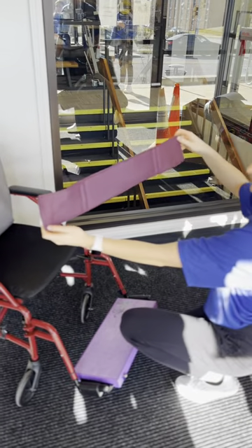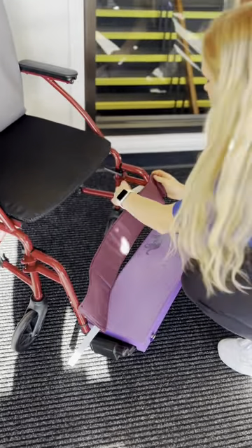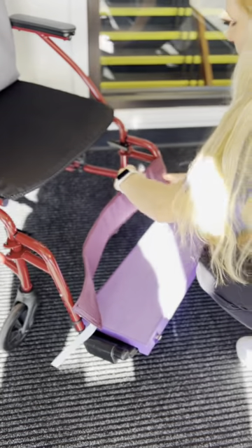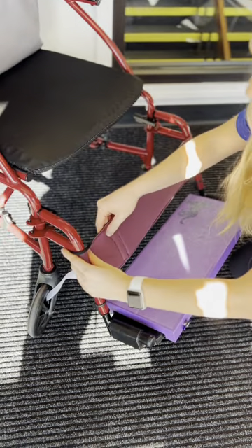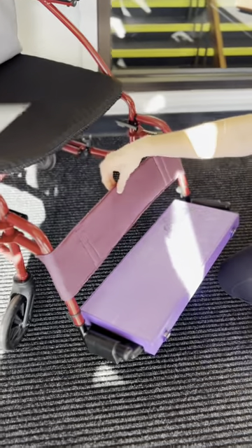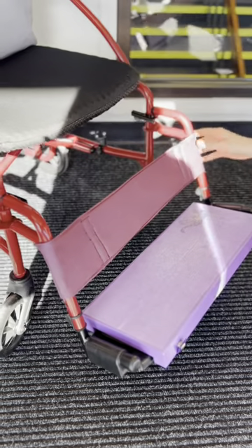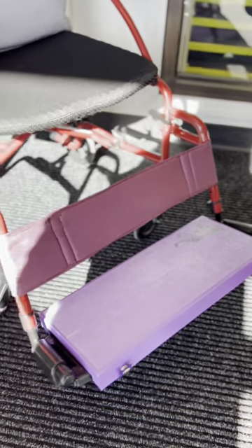The calf strap was made with recycled fabric and foam and was further modified with velcro to ensure a proper fit to the manual wheelchair. Since our client crosses her legs in the middle, they sometimes fall behind the footrest. Our client has limited control of her lower extremities, so the addition of the calf strap will ensure her feet remain in the proper position on the footrest.